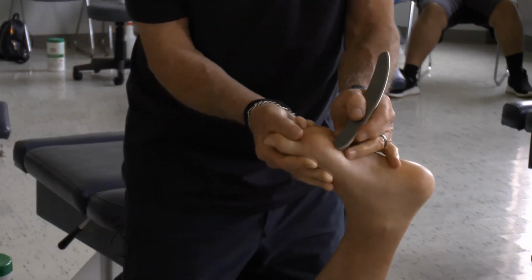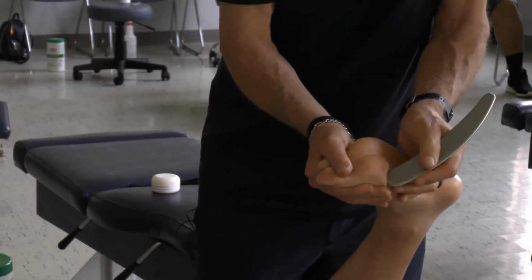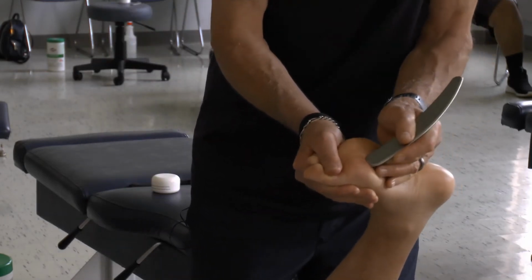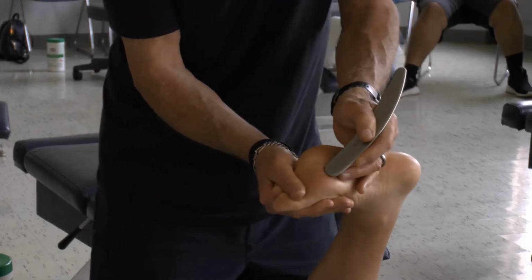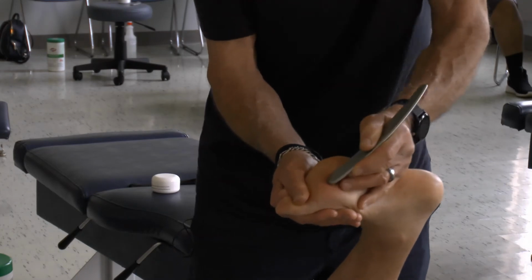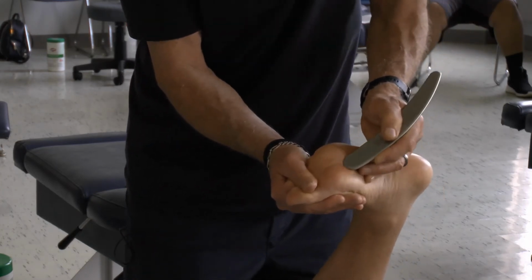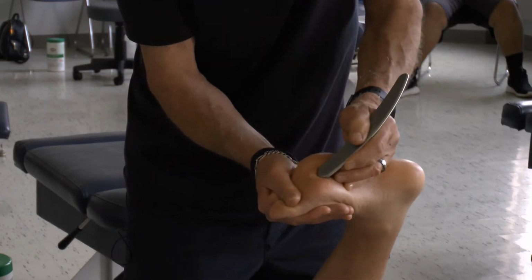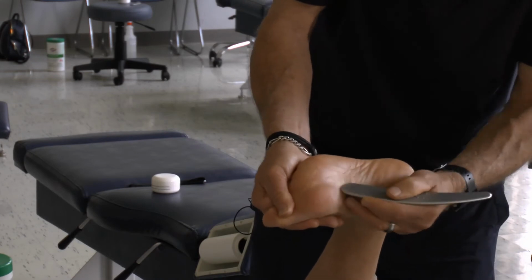Going to change over to a pencil grip. Doing okay? Yeah. All right. Now, in a symptomatic patient, you might not be able to do all this, so you get what you can and just do it in shorter intervals. I'm going to come across the tissues here as well.